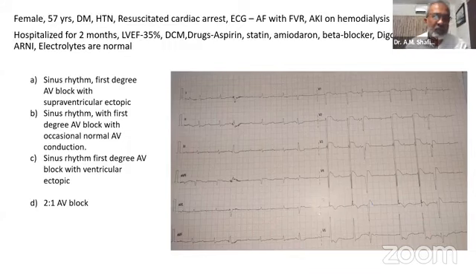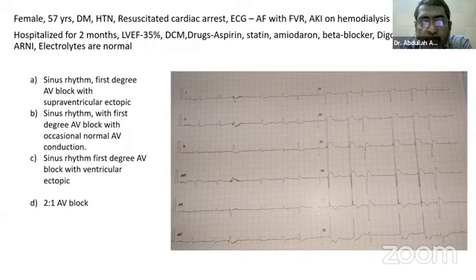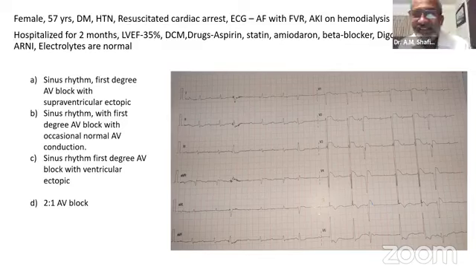Yeah. But if you look at the P wave character in V1, this is biphasic, also in V2. So I think at first glance, yes, sir, it is number C.